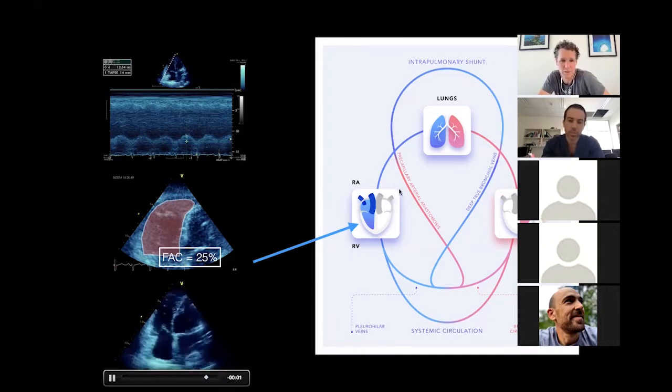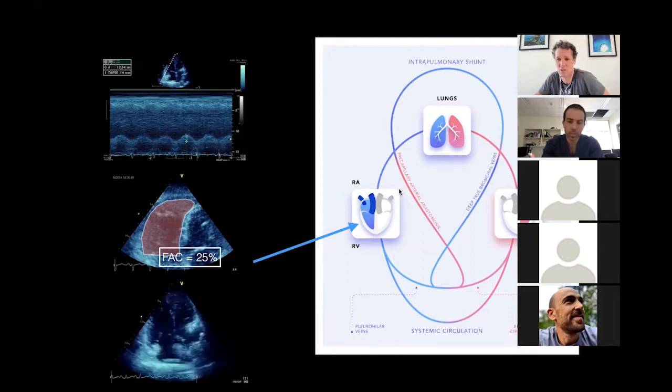Sorry to jump around. Yeah, I guess they're just things that I often notice before I start doing the diastology. Absolutely, I'm not saying it's wrong. I just think in terms of exam technique, you want to put the examiner at ease and start with the simple things first. Because on the marking sheet, they may have B bump and L wave, but it's right down at the bottom of the list. Those first things they're talking about are everything you mentioned, but making it easy for the examiner is the go.